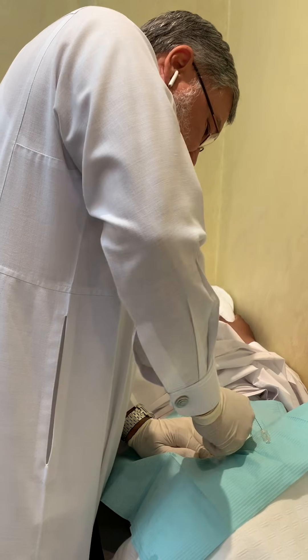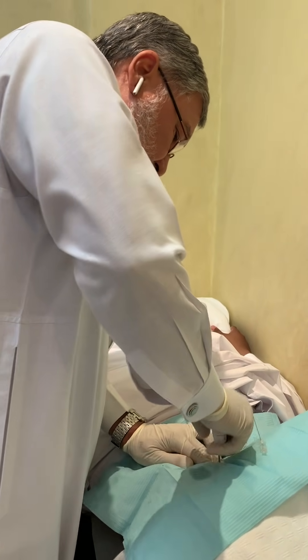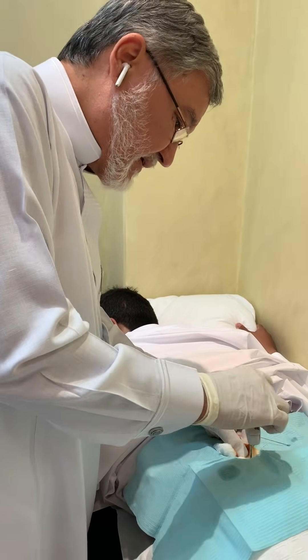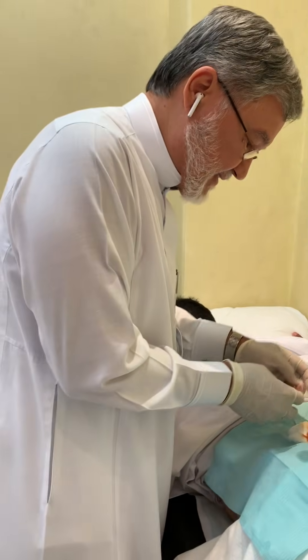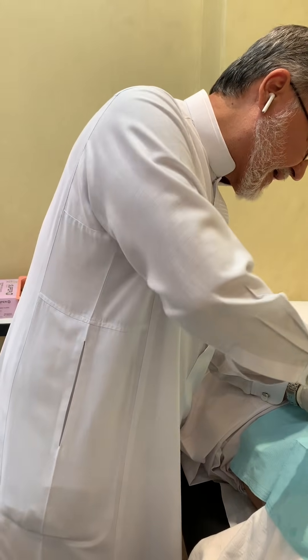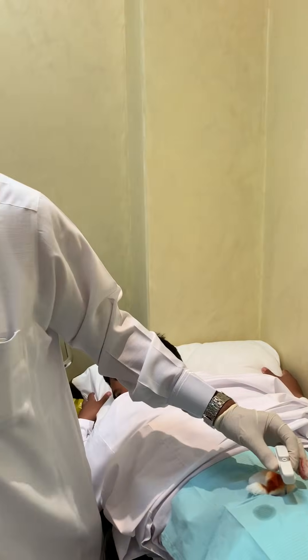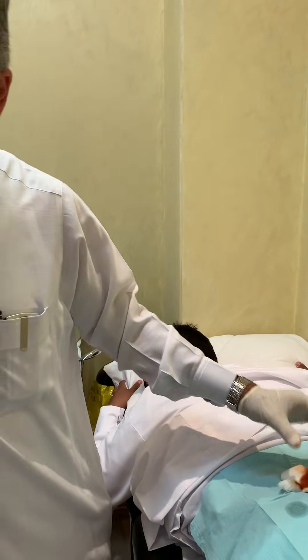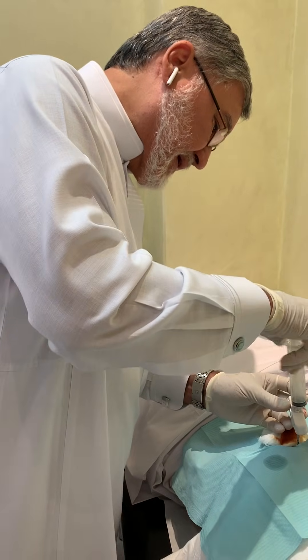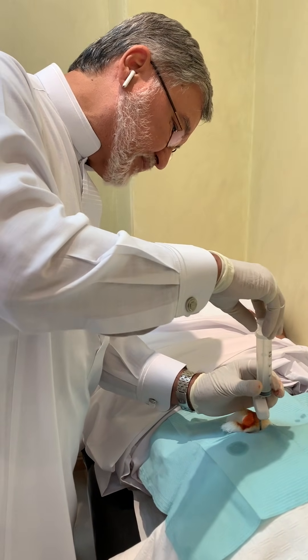I have to inform the patient that I will start. I am on the periost — I am boring, trying to cross the compact layer of the bone. I crossed it — I know because the biopsy needle is now fixed. I remove the stylus; it's still fixed. With this syringe I'll try to aspirate a small sample.